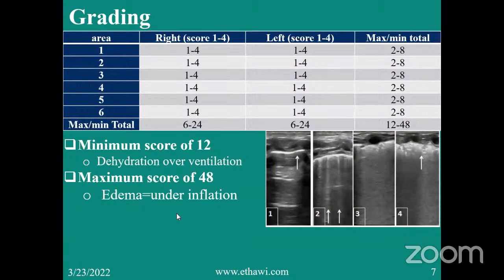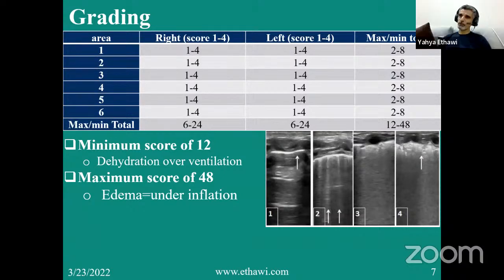When we are doing a scan, suppose the zones R1, R2, R3, when we don't find an abnormality and we feel it's a normal lung, what score should we give? Well, first, you should not do a scan without a history. You are doing the scan for something else, because you want to confirm or exclude something. So we don't say normal lung without a clinical context.